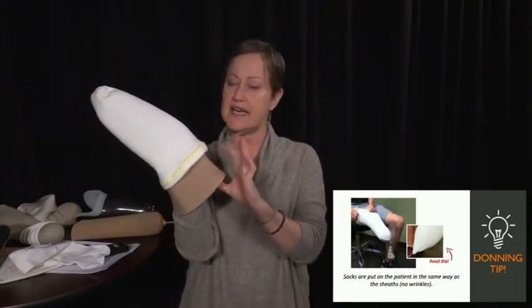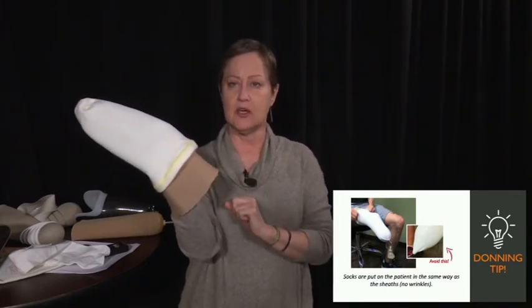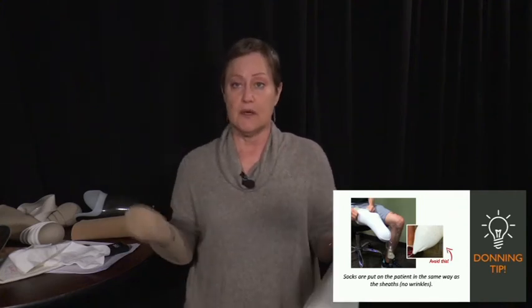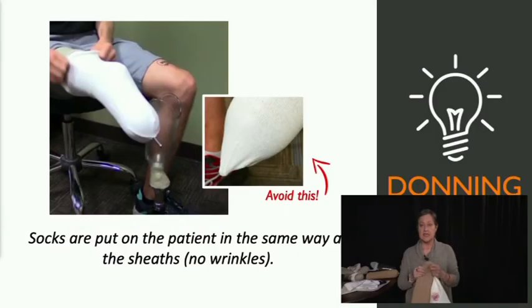And in a lot of cases, depending on the suspension system, you might have some length of the liner sticking out over the top of the sock. The whole goal here is for the leg to feel snug. There shouldn't be any wrinkles. Teaching the patient to lean over and feel the end of the sock to make sure it's all the way flush to the liner is also a really helpful thing to work on in therapy.